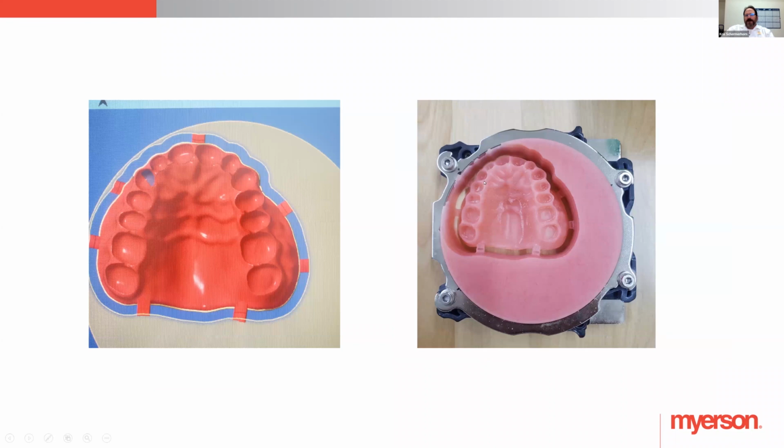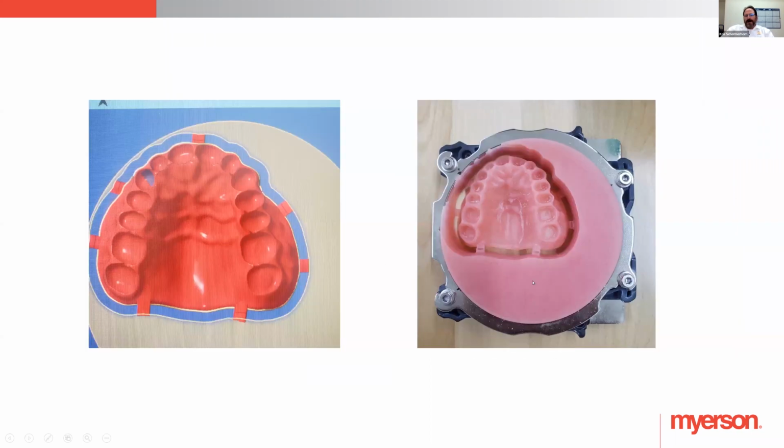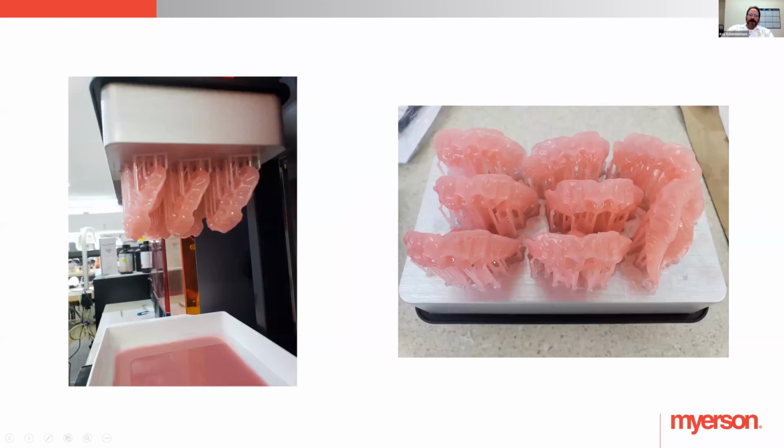This case here, depending on the mill you're using, could be in there for several hours, as was this one. The difference is I got one denture base out of that several hour time period, whereas in this case, I have 7, 8 dentures that can be done. So that's where we would all hope to get to as far as volume is concerned. And I think we're getting there. There's definitely some materials available now. I think there are going to be much better materials coming in the future, but you do have that option.